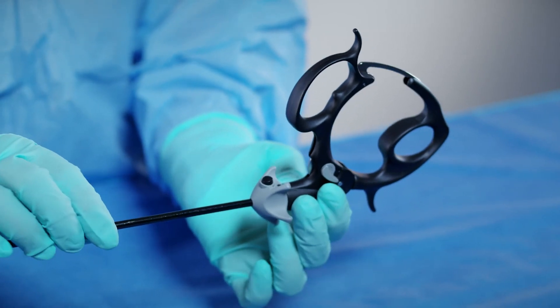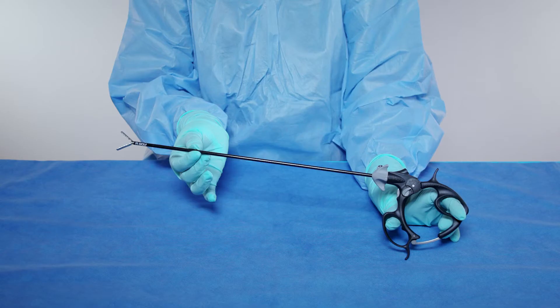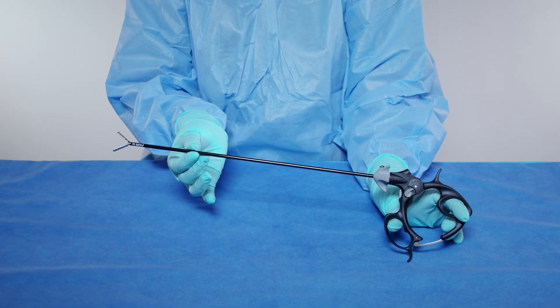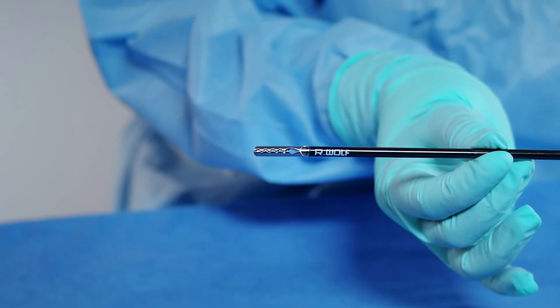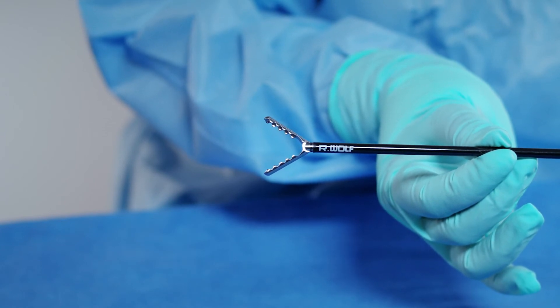The sheath tube and the handle should click into place. Only a slight effort will be required if the instrument is assembled correctly. Confirm successful assembly of the instrument by opening and closing the handle. The jaw tips should open and close in response. You have now successfully assembled the instrument.